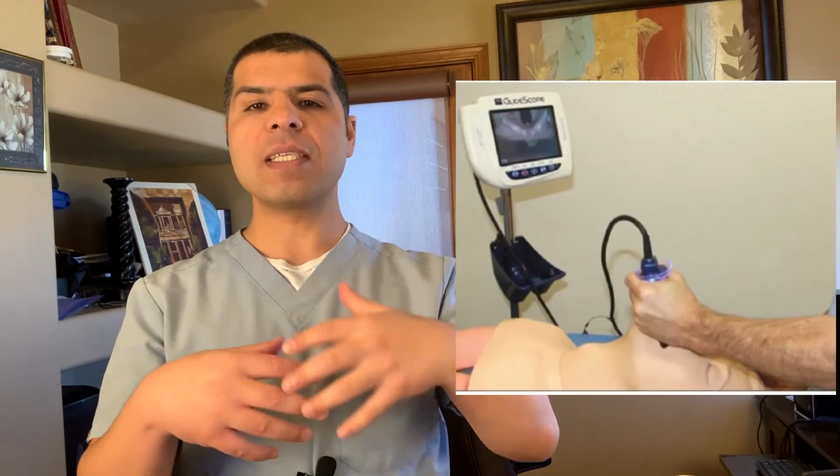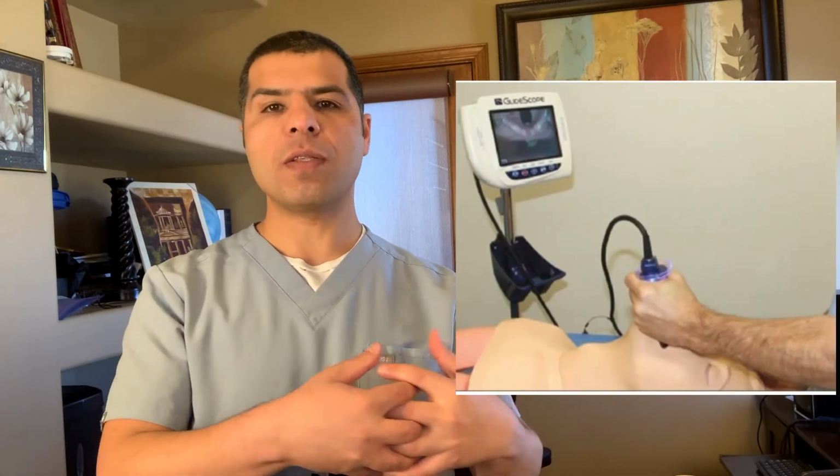Now the patient is sedated. What's next? Probably a lot of you say, go ahead and chase it with paralytics. Let's push paralytics. I usually, by this time, have made up my mind how easy intubation in this patient will be. If intubation is anticipated to be difficult, fat neck, abnormal anatomy, history of previous difficult intubation, before I push paralytics, I grab my laryngoscope and take a quick look and see how easy it is to visualize the vocal cords.